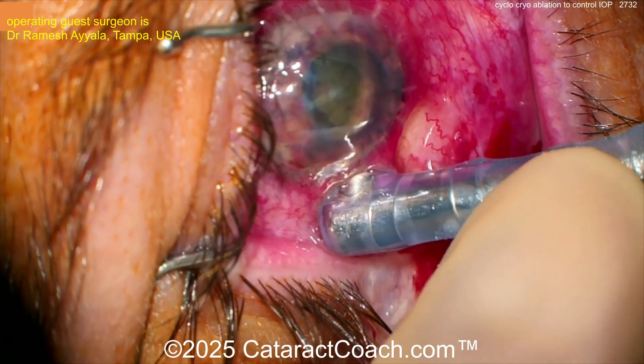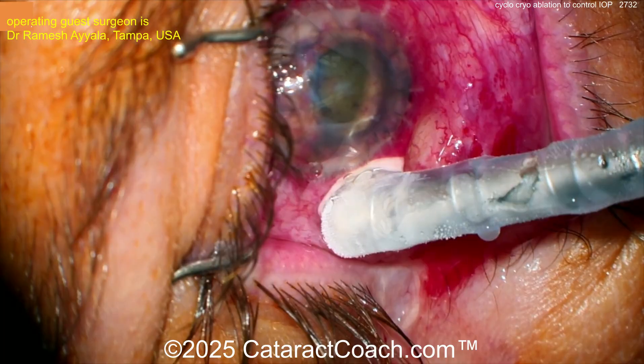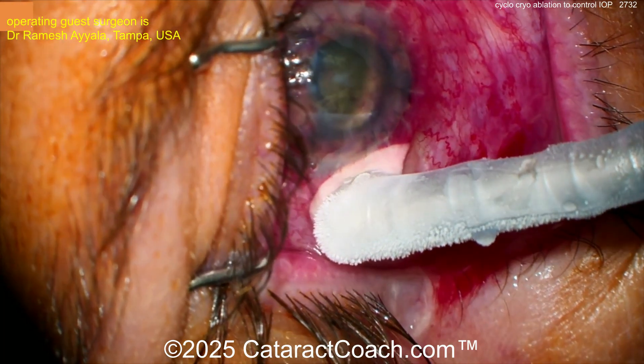Four spots, maybe five spots total, inferior 180 degrees. Do this with a good retrobulbar or peribulbar injection — use lidocaine at least with some epi, and also perhaps put in some bupivacaine or marcaine to give longer-term anesthesia.